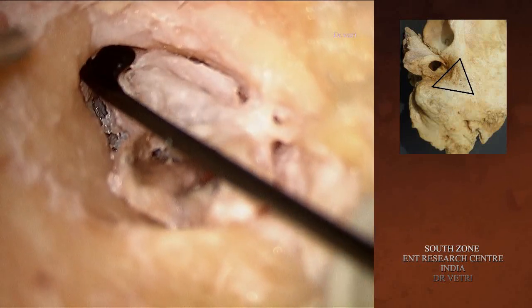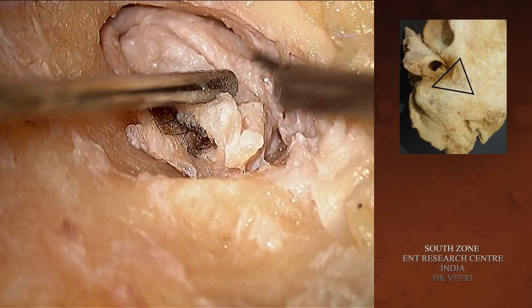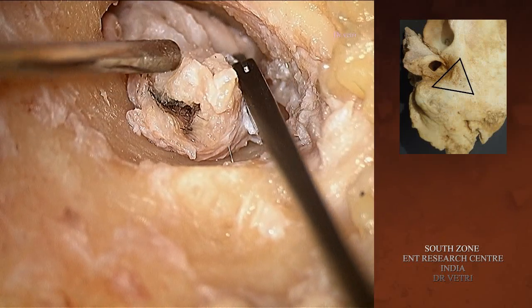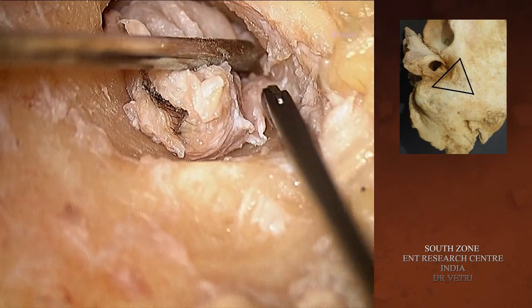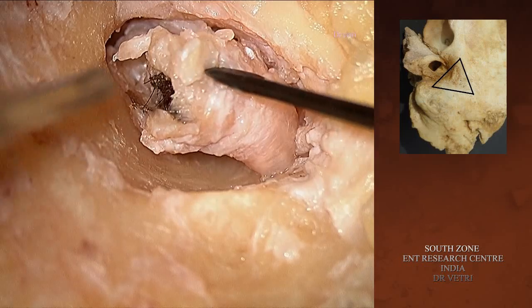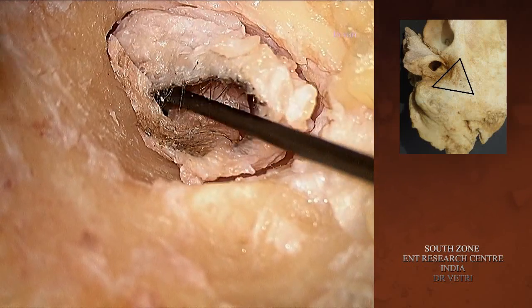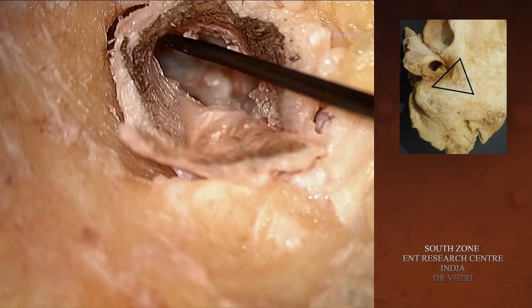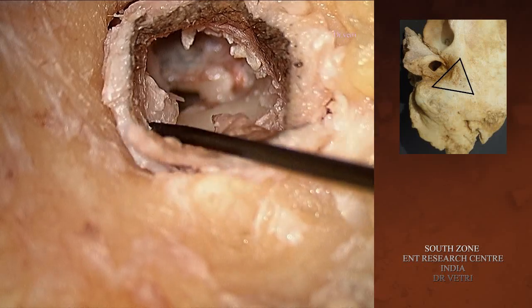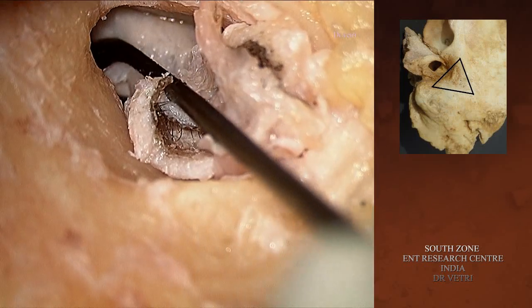The anterior skin wall is gently elevated now, using scissors to cut the periosteal attachment. While elevating the posterior canal wall skin, the skin is very thin in the posterior part and it is firmly attached to the tympanomastoid suture line. Tear is very common at that place, so be very careful.